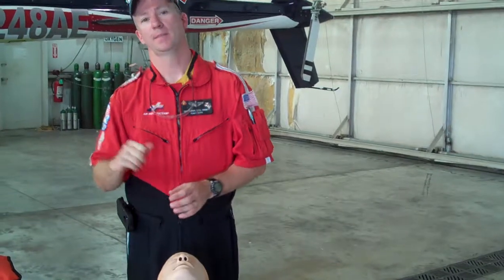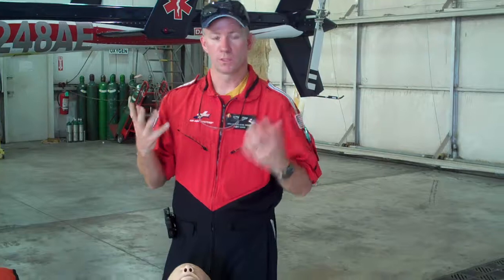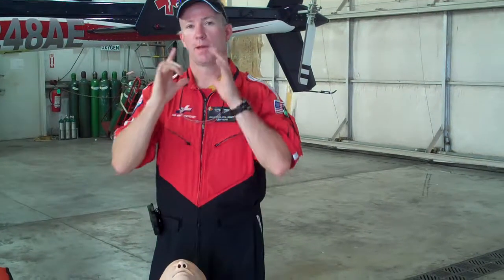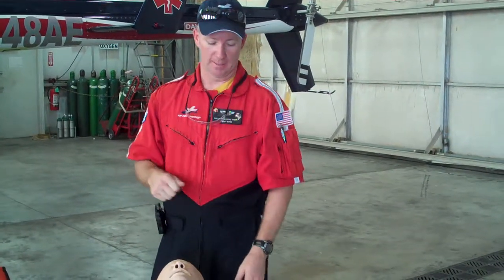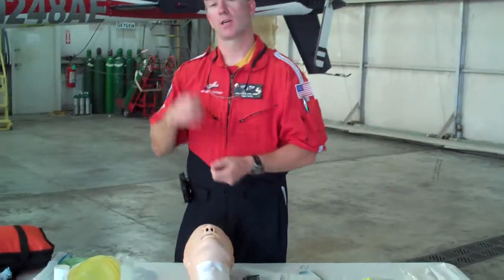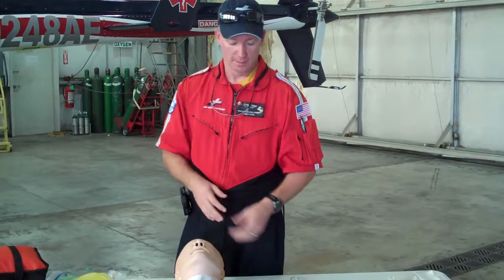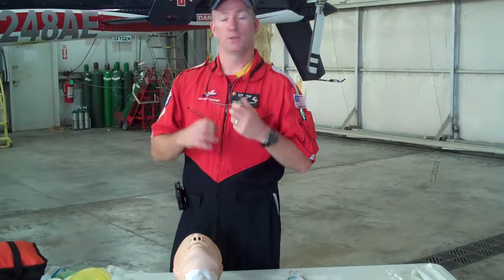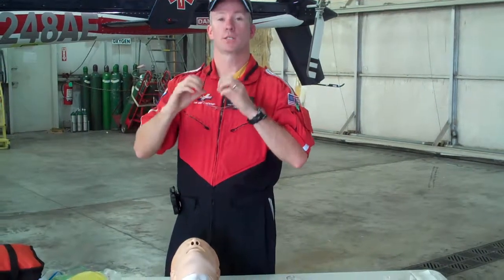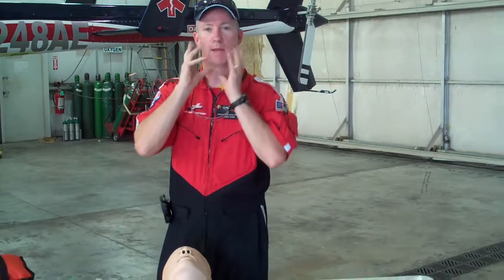So let's go back and pretend I was bag valve masking this patient, and we're having a lot of difficulty bagging the patient due to severe facial trauma, we'll say. I can't get a good seal with my mask on the patient's face. I'm unable to bag them. So I rapidly grab my laryngoscope and my endotracheal tube, and I go in to try to get this patient intubated rapidly because they're typically not breathing or they're not oxygenating well. And we realize real fast that the landmarks we look for when intubating a patient and where to place the tube are unrecognizable. There's so much trauma to the neck and the mouth.